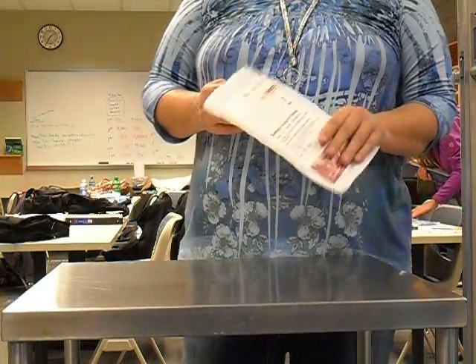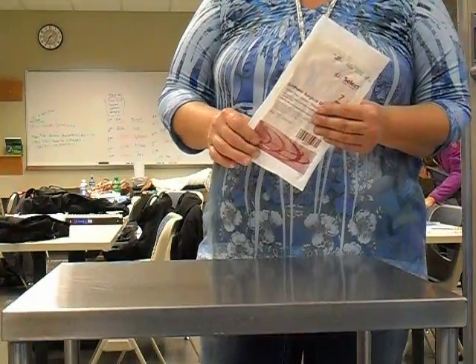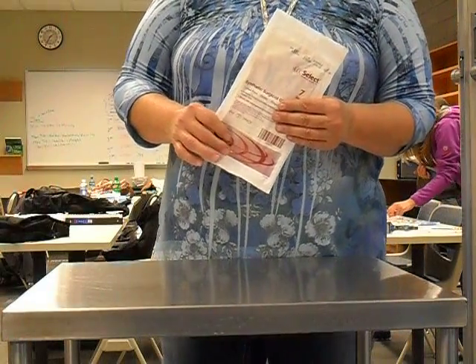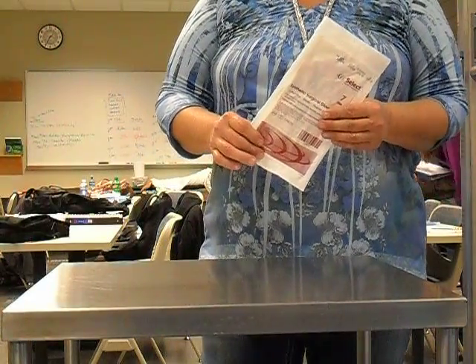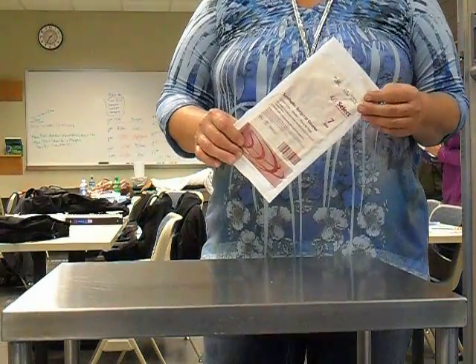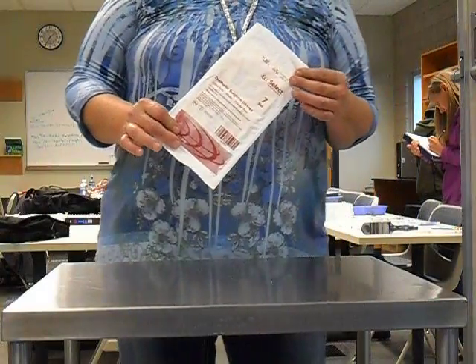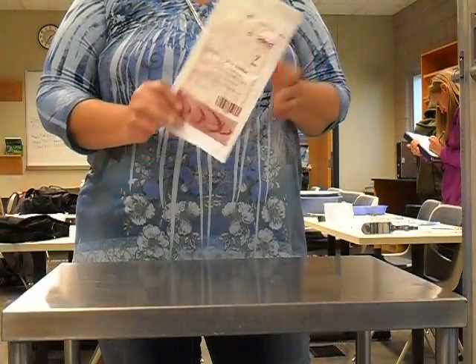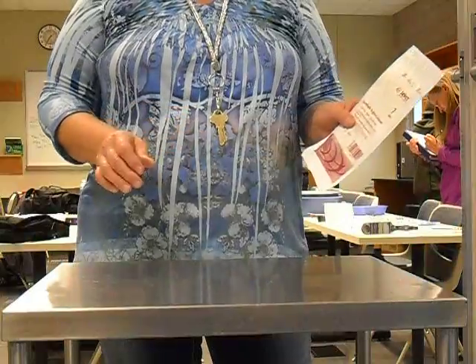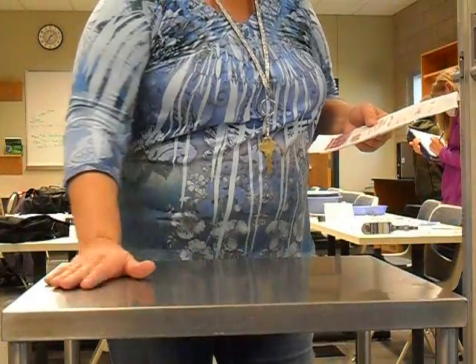Gloving. And open gloving is a skill that you would use if you were going to perhaps prep the patient, or maybe you're going to put in a Foley catheter in a patient. The nurses will use it a lot on the nursing units to do dressing changes and such. And so we're going to start with a pair of sterile gloves, and we need a solid surface that does not have to be sterile.